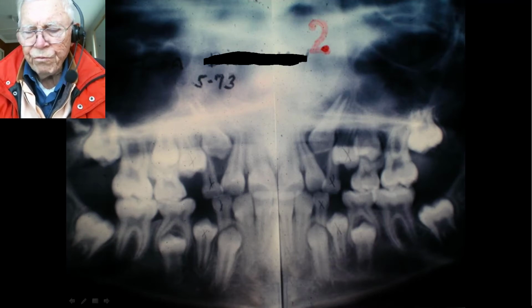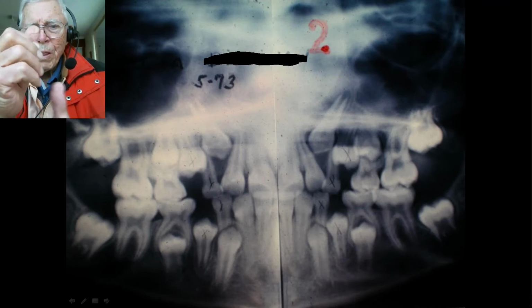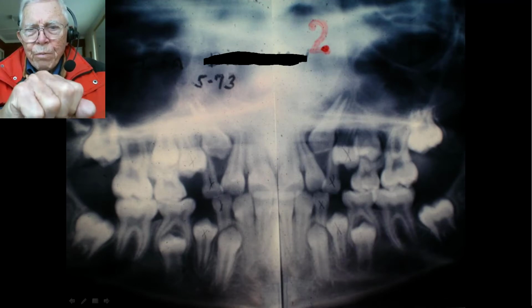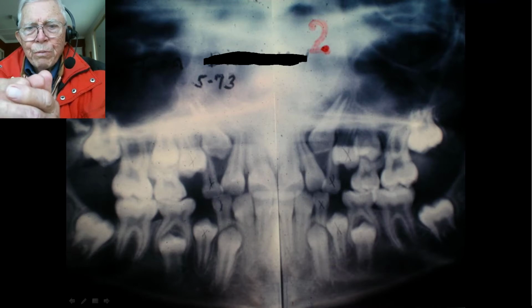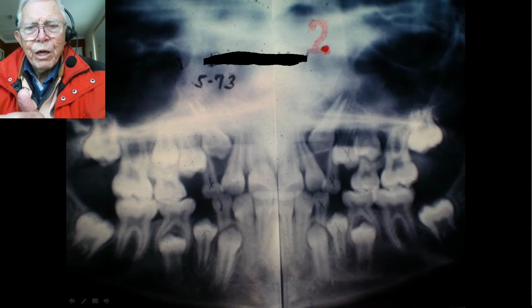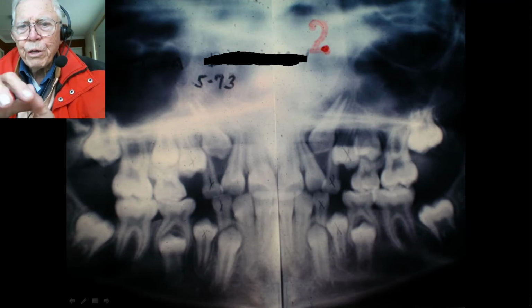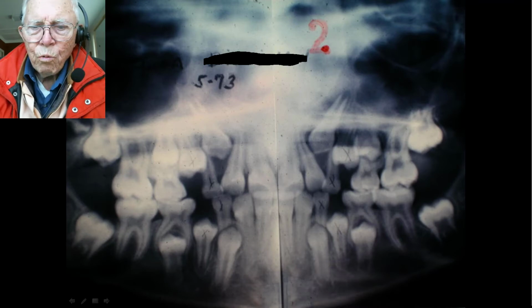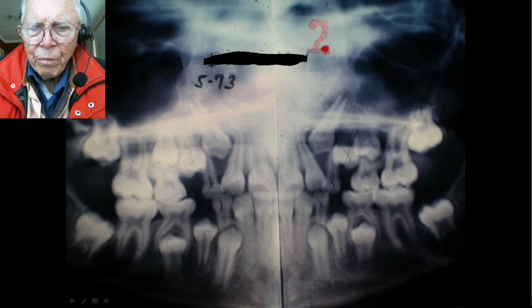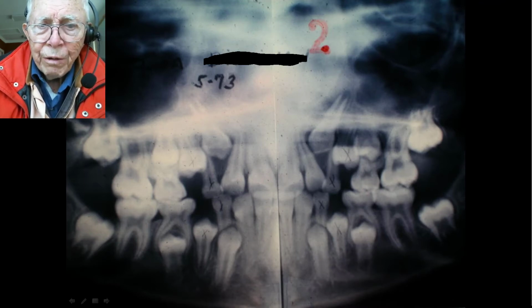Now this follicle is kind of like a balloon around the tooth, and it's full of liquid. And if you push it up against something on one side, it'll round out. If there's nothing else on the other side, nothing tooth structure, it will just round out. And it will do that even in bone. So watch that perform here now. This is a year and a month, I think, after we took this tooth out in here.